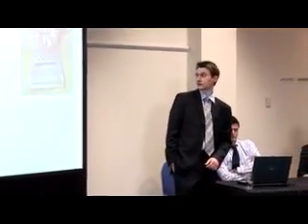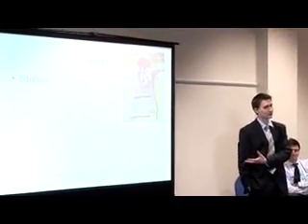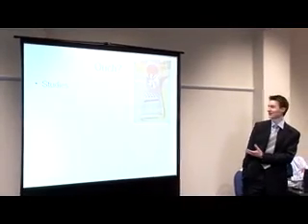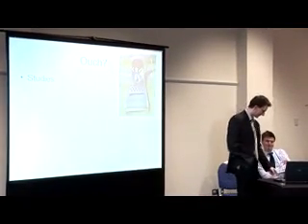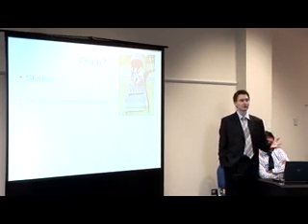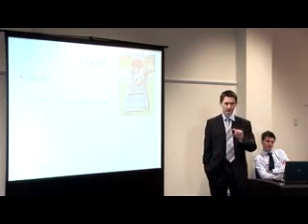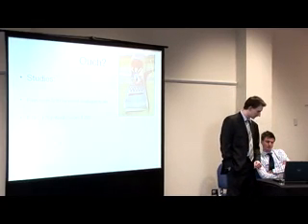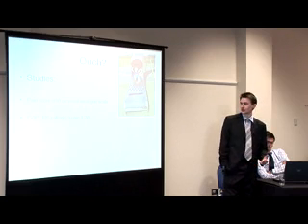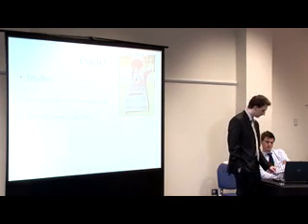So does it hurt? Well, it didn't particularly hurt Michelle Fox there, but then Michelle Fox has a vested interest. We don't even know if she was pre-medicated before she did that. There's been a few studies. Pain score 5 out of 10 in people who had it done on the visual analog scale, in the first one of a few hundred patients. And the second one, an EZ-IO study, they looked at 125 patients. The pain score was 1.2 out of 5 when they averaged them.